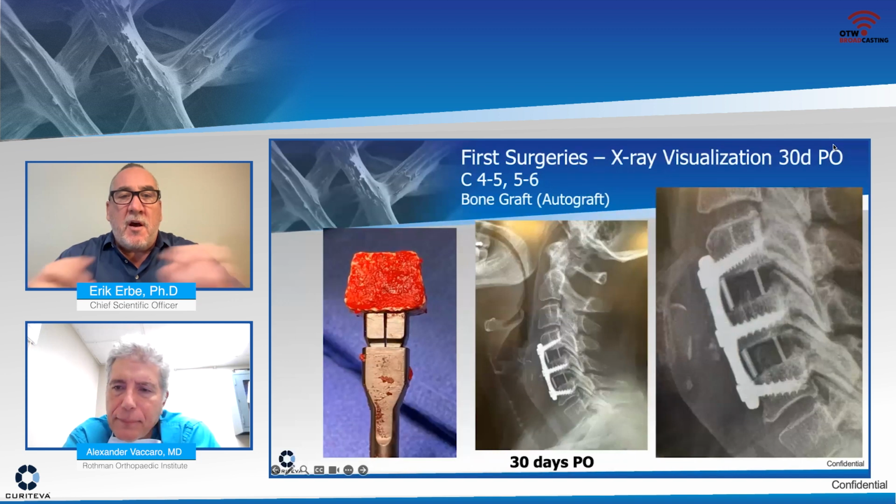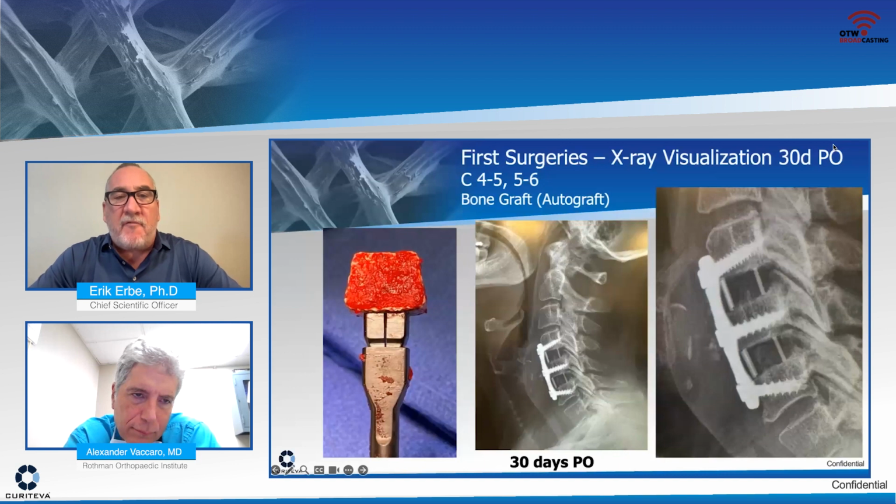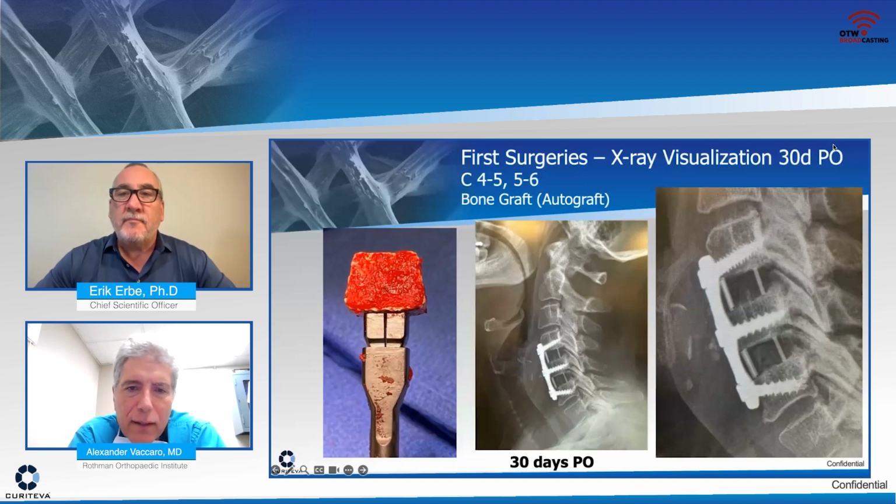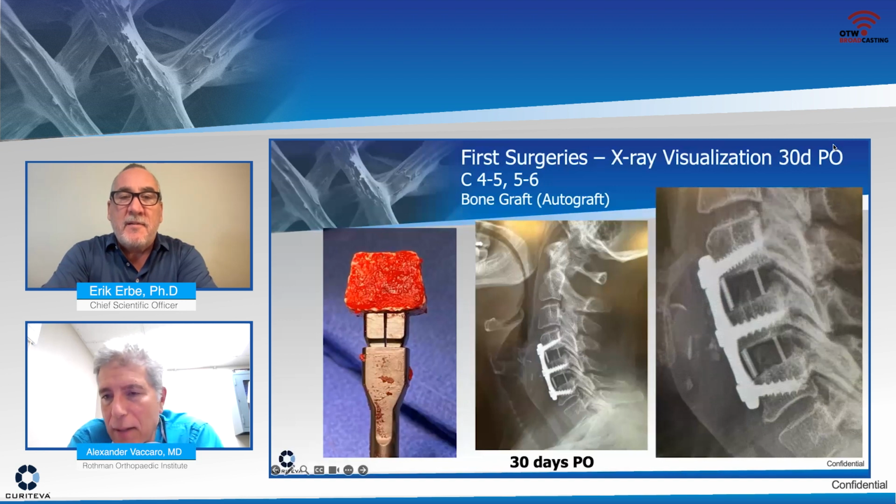So this is the other implant, the same implant, but the same technique using autograft and local bone. Early responses. I don't know if you want to say something about this as well before we get to the CTs. Yeah, I love Kevin's technique of taking local bone. He uses the burr. He catches the bone fragments and the dust, and then he sort of imprints it within the interbody space in the center of it. And it looks like a solid piece of cancellous bone, which is a great way of doing it, because you're using the osteogenic potential of the patient's own bone. And then you add it to the osteoconductive features of this interbody implant where cells love.